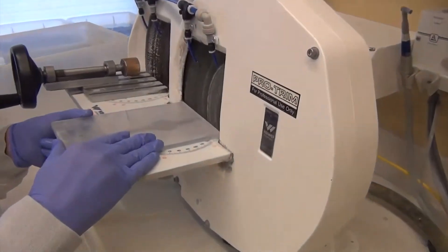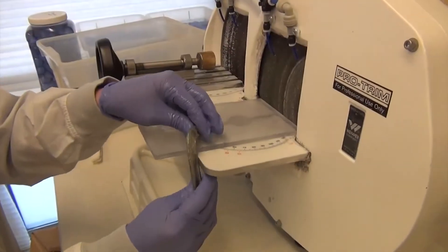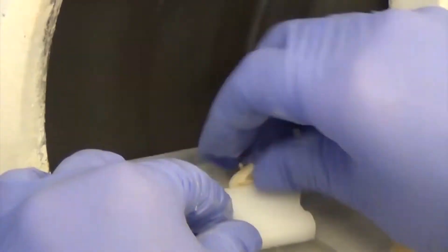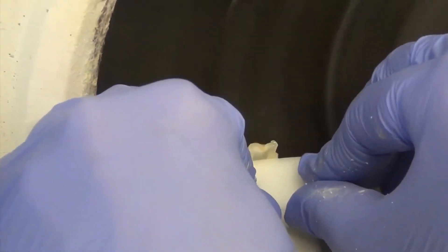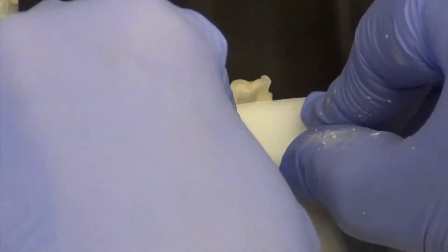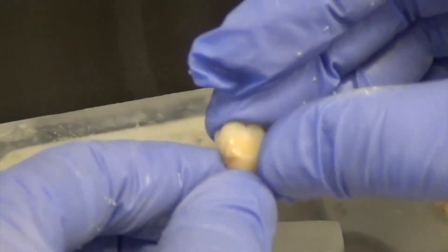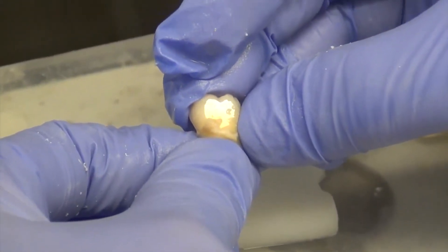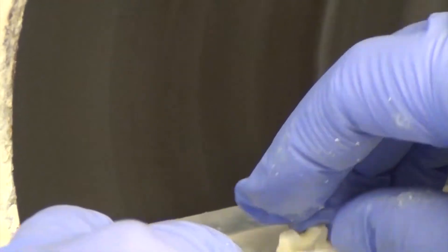The next step after sectioning is to mount a plastic plate against a grinding wheel so that the teeth don't slip through when you start to grind these small flats. The flat will be necessary so that we can put that on the plate in the mold and hold that down, so if we don't have that flat the tooth will wobble and rock when we pour the acrylic around it.